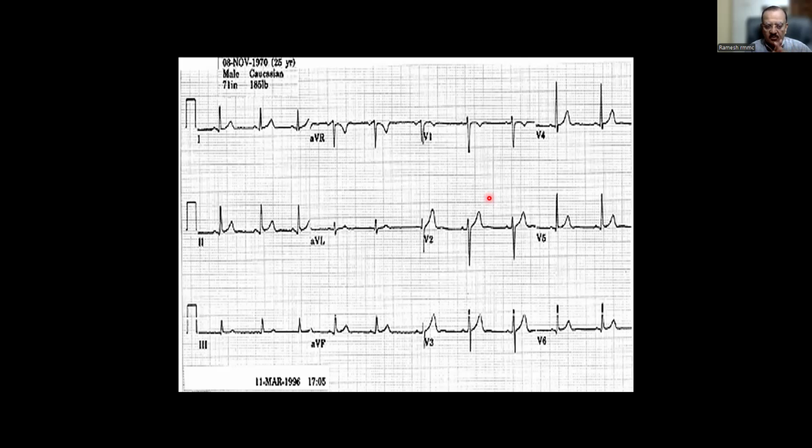Right. Now, come to the QRS. Try to interpret this QRS. You concentrate on V5 and V6. Let us say V6. Quite normal, sir. What is the amplitude? About 15, I think it's not very clear. What is the upper limit? 26. Everybody please attempt. You will remember it, right? 26, so is it within that or more than that?